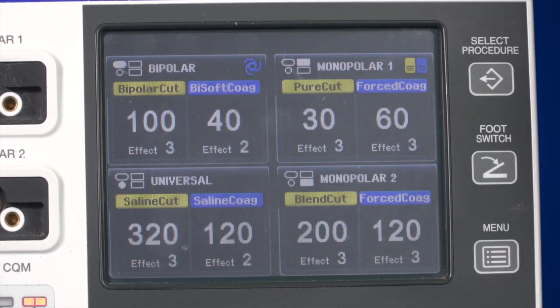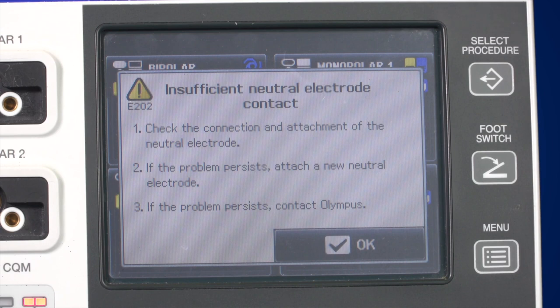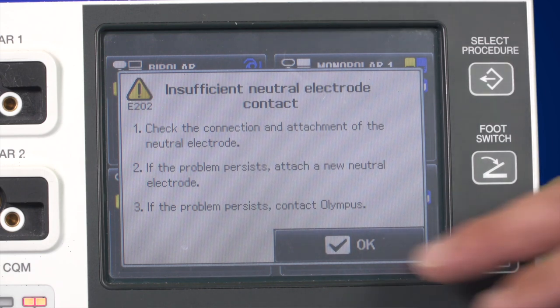There are certain situations in which the ESG400 displays an error message. The screen will display what to do for 10 seconds. Alternatively, press OK or activate the instrument to clear the message.